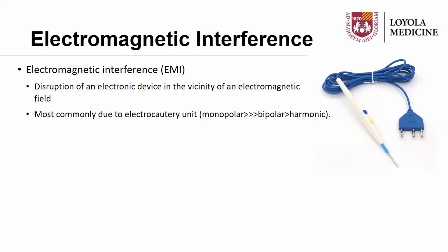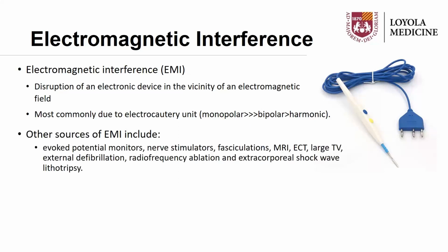There are also some less intuitive sources of EMI to consider, such as evoked potential monitors, nerve stimulators, even fasciculations, MRI, ECT, large tidal volumes, which I thought was interesting, external defibrillation, ablation, and of course, shockwave lithotripsy.